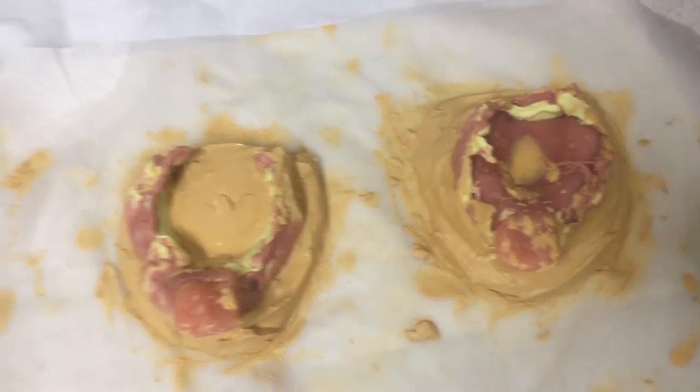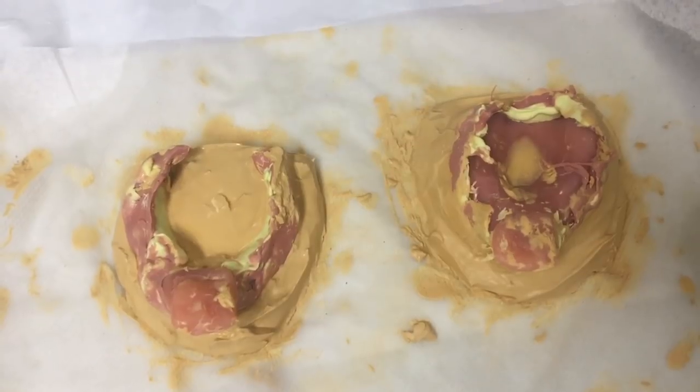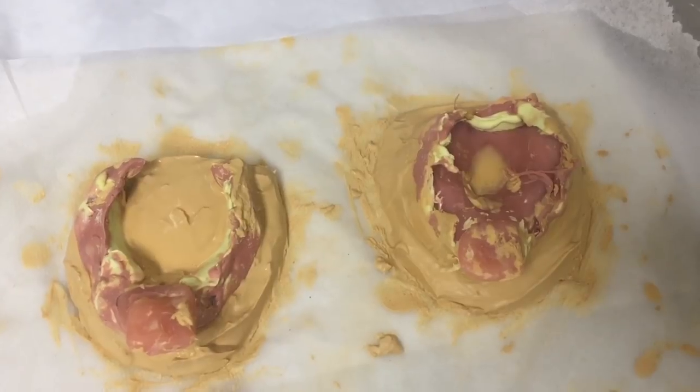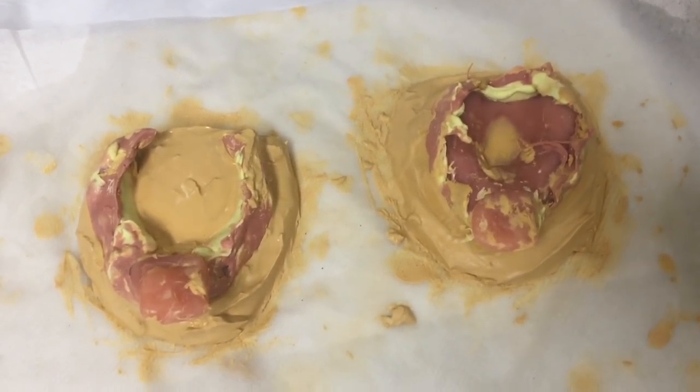Here are the custom trays I used to border mold using PVS light body and heavy body. I've already poured the yellow stone on them and they're waiting to dry — these are the master impressions. They do look a bit rough, but I am a dental student after all. Thank you so much for watching, and hopefully you'll see part two. Bye bye!